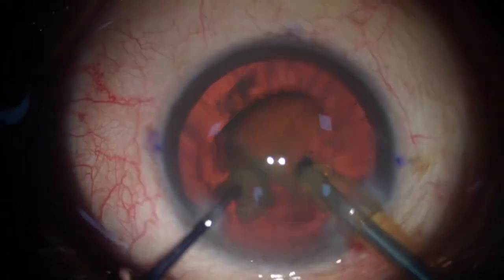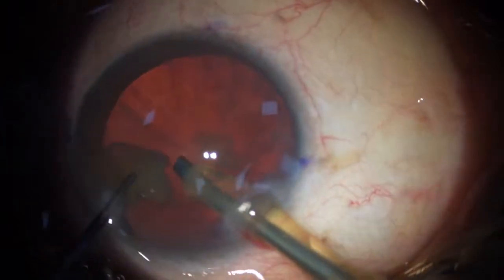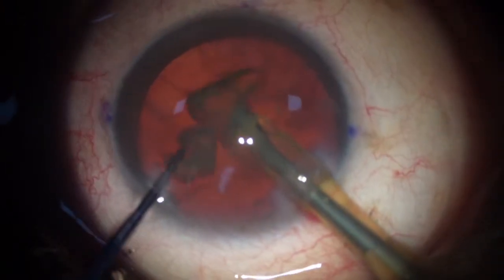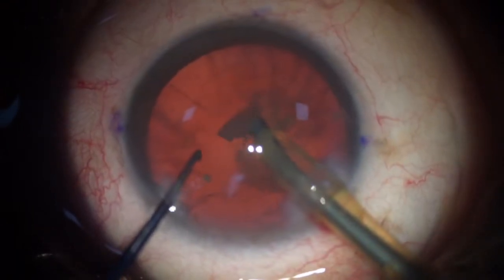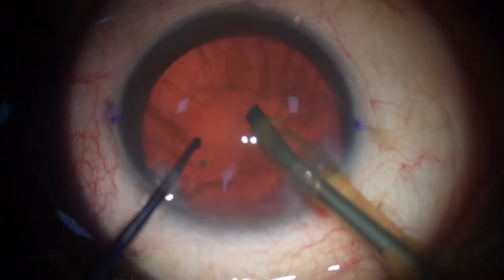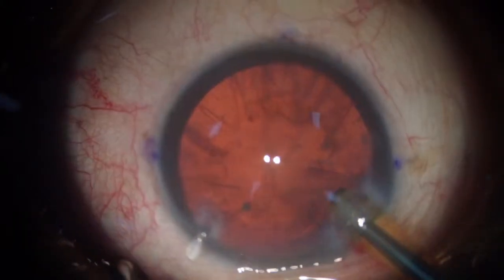So under topical anesthesia, there are things like high myopes. If you have a sudden deepening of the chamber, they will suddenly feel pain. So that's why another advantage of doing low IOP phaco here, because high myopes typically will have sudden pain as soon as you distend the chamber and start the infusion. And then depending on the grade of cataract, you can use the power as much as is required. So we've been able to remove the nucleus.